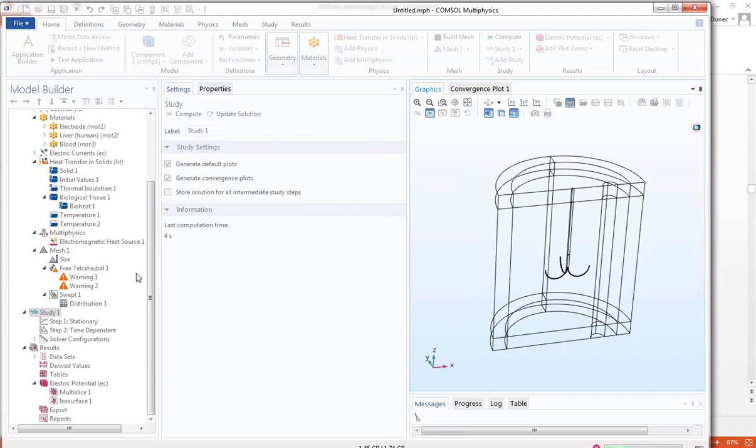Okay. Now the next thing I'm going to do, and I'm running a little short on time, so I'm going to do this quickly, is to switch it to a frequency-dependent analysis. And then the third thing that I'm going to do is to fairly quickly add an actual necrosis calculation. Okay. So we're almost done here. Just waiting for that green bar to make it all the way across.